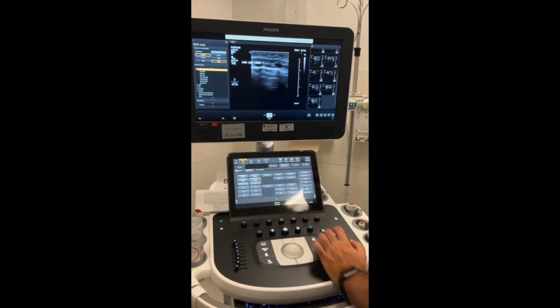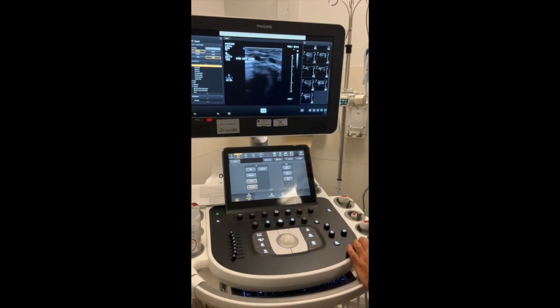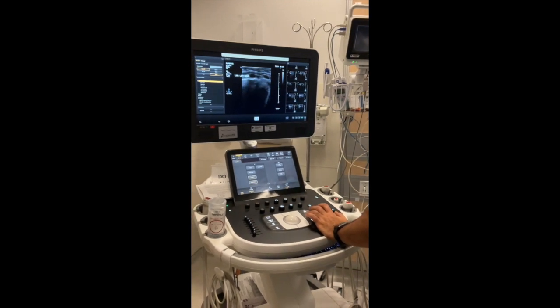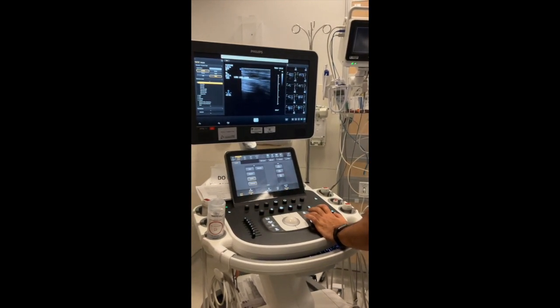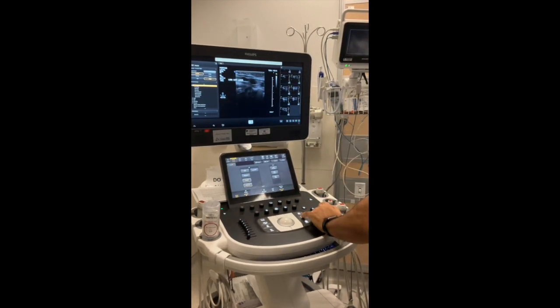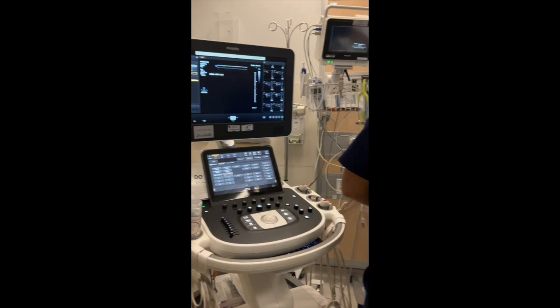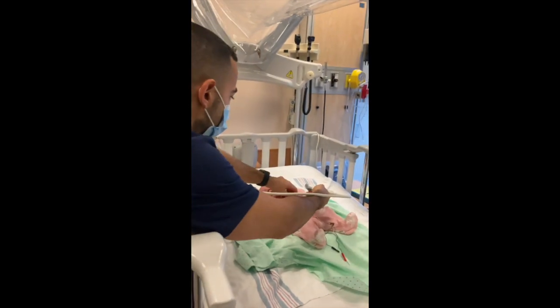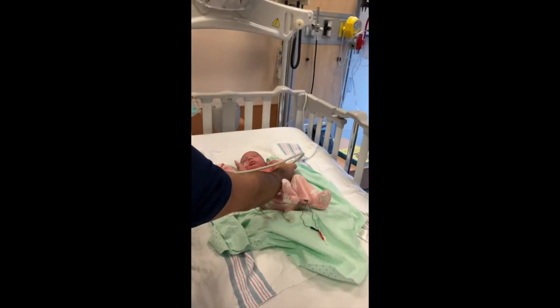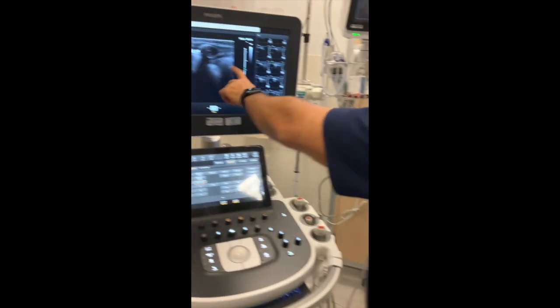Now I will do the same on the lower lobe, starting at the nipple line. I go down where I can actually see a bit of the heart, so I do little movements on the chest to see more lung tissue. Here I get to the diaphragmatic area. I finish with my lateral, which needs to go at the mid-axillary line, then slide down until I see the diaphragm.